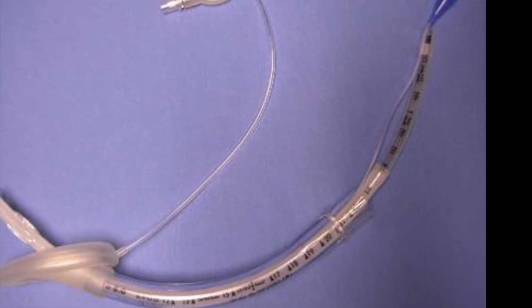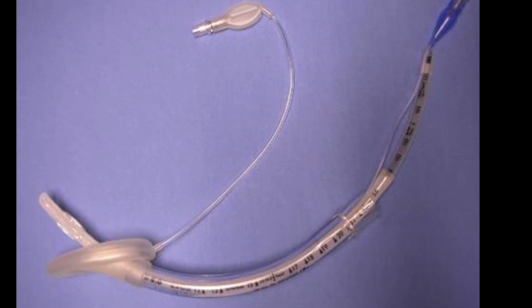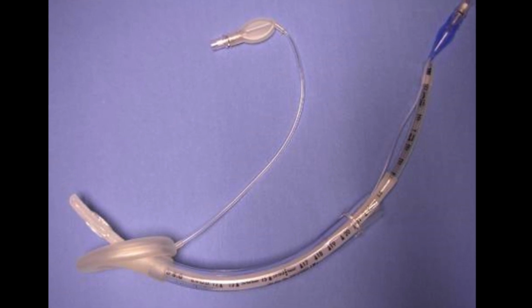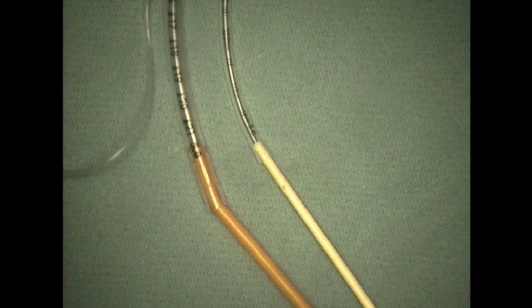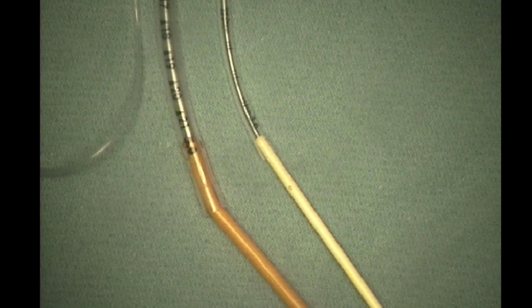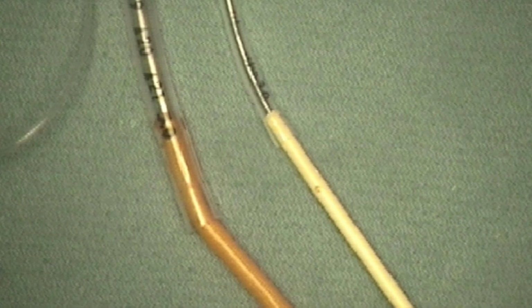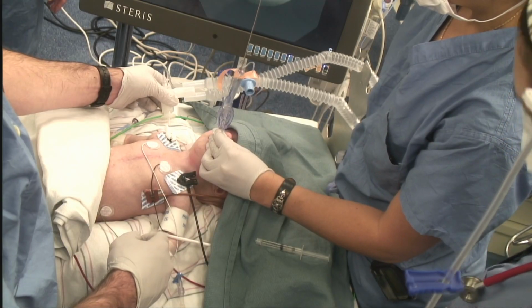This shortened two tracheal tube method minimizes the circuit disconnect to as little as 5 seconds, which may be beneficial in our most at-risk patients with minimal cardiopulmonary reserve, such as patients with severe pulmonary hypertension. Large enough bougies, stylettes, or tube exchangers that can get wedged into the tracheal tube can be employed as stabilizers. However, these can get stuck in the tube, making it difficult to remove, so are not recommended.